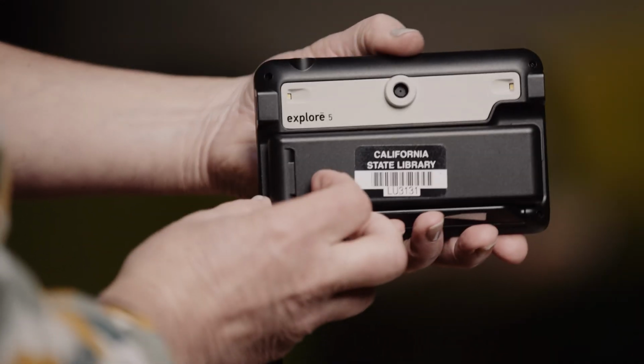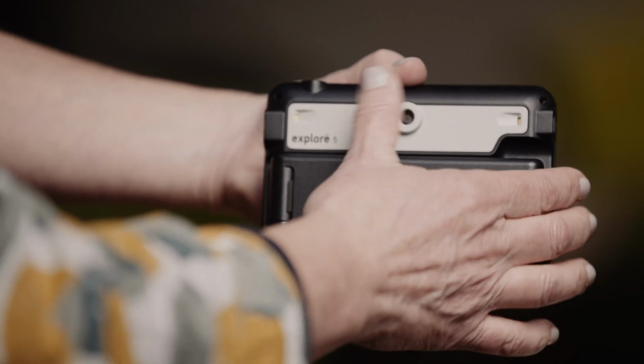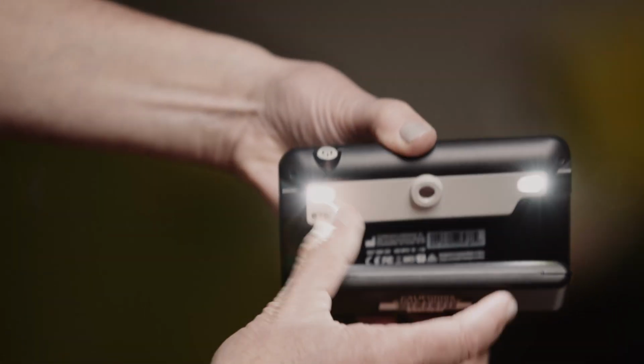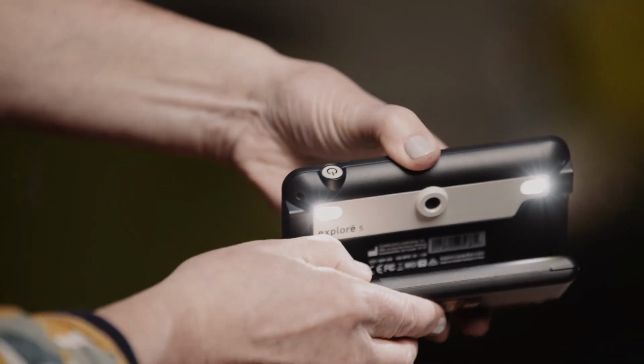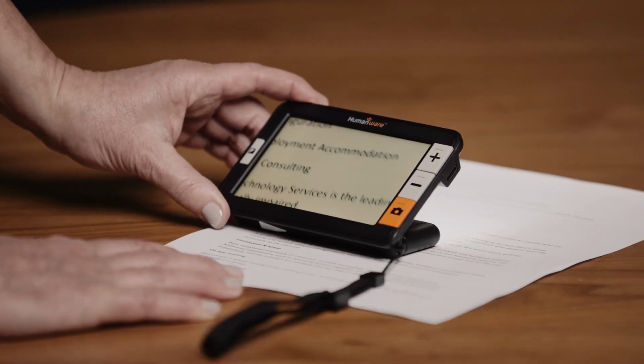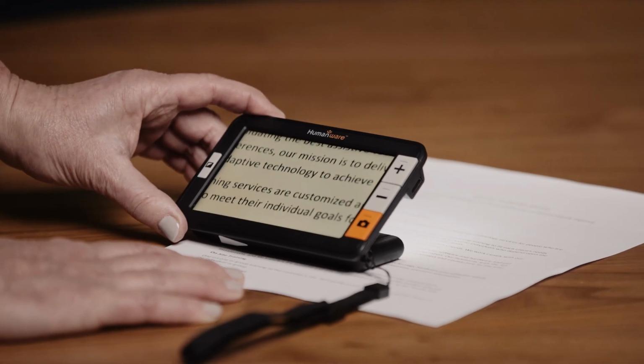Using the handle as a hands-free stand. The Explore 5 handle can be used as a hands-free stand. The stand will hold the screen at an easy-to-read angle when placed on a desk or table.